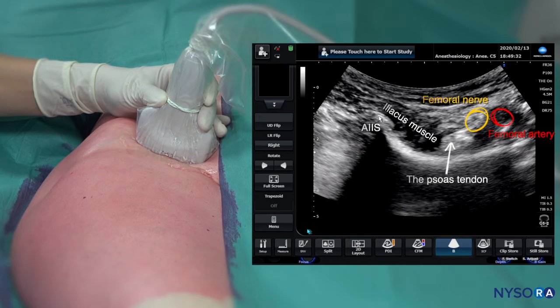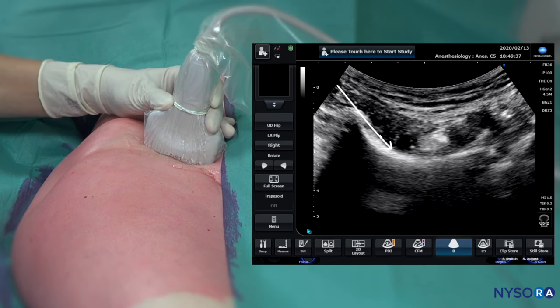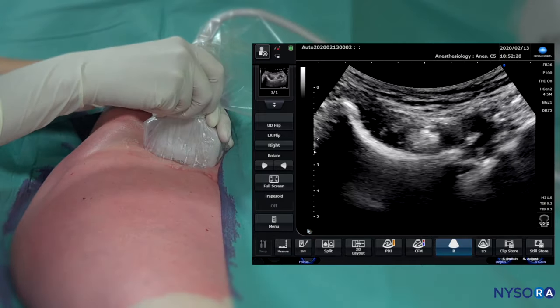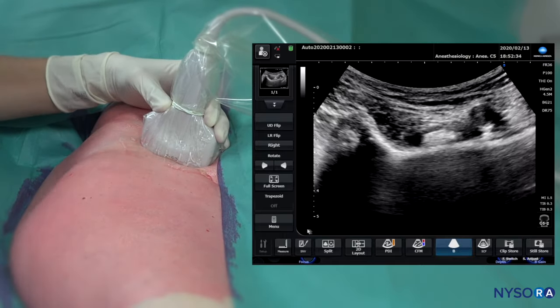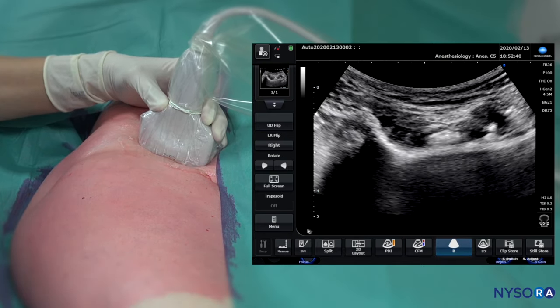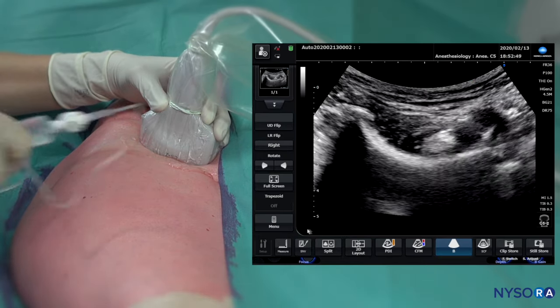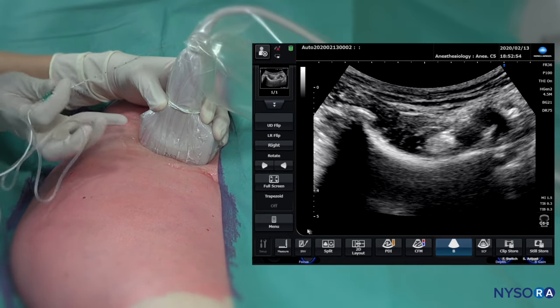The technique consists of placing a needle to scrape by the anterior inferior iliac spine and to land on the pubic ramus, where we inject the local anesthetic to layer out underneath the iliacus muscle. Even though this is not a nerve block technique per se, we prefer always using nerve stimulation. The purpose is that it is not uncommon for trainees to direct the needle towards the femoral nerve, which we definitely want to avoid. We also use injection pressure monitoring to rule out injection into the tendon rather than underneath the iliacus muscle.